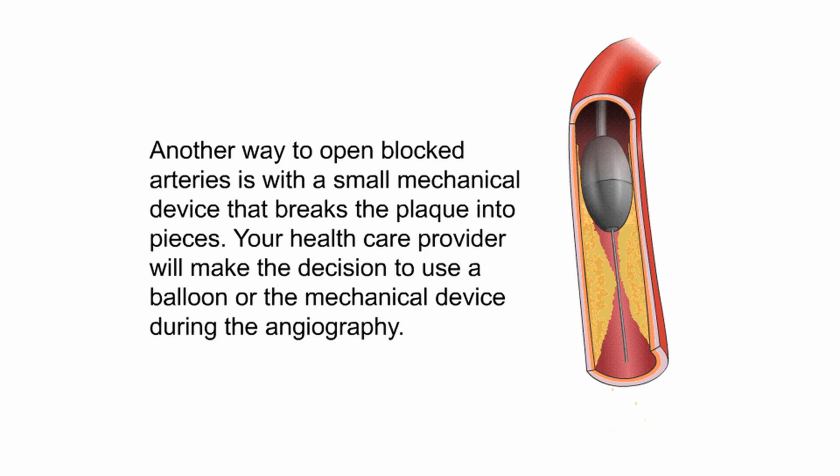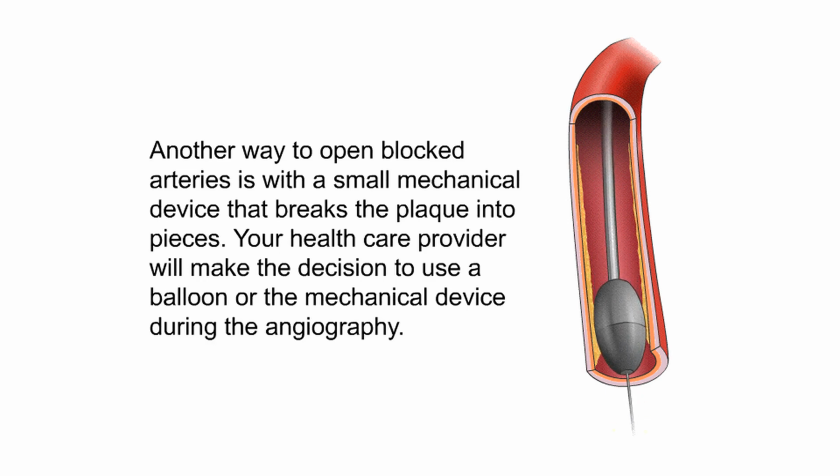Another way to open blocked arteries is with a small mechanical device that breaks the plaque into pieces. Your healthcare provider will make the decision to use a balloon or the mechanical device during the angiography.